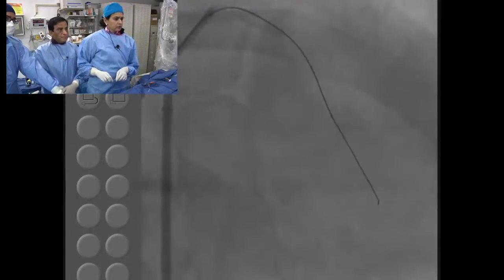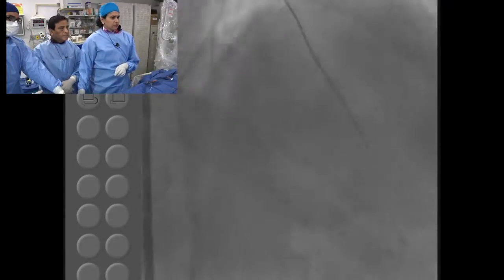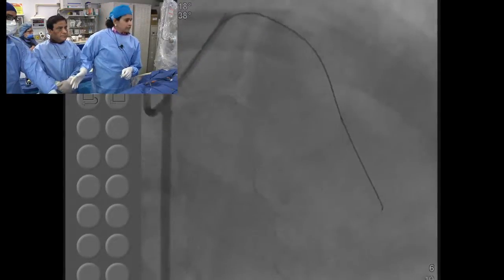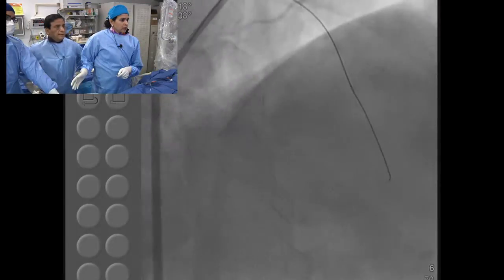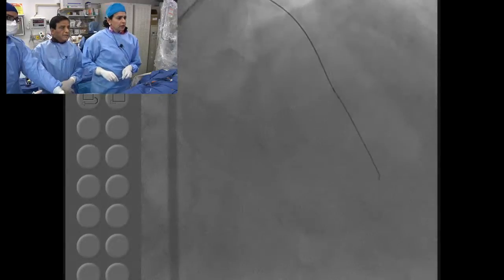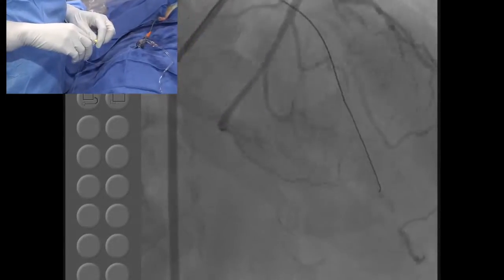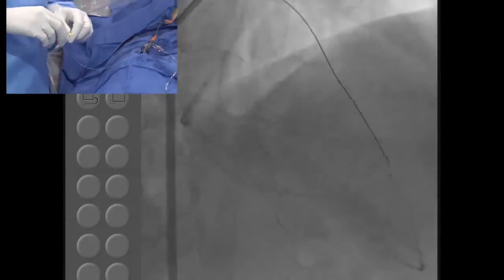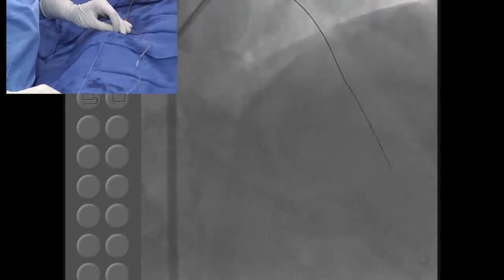Anu, beautiful job with the wire in the meantime. I think you appear to be on the right track. I want you to describe the motion which you have been doing, would you call it drilling? Yeah. We have to inject. I think it may be parallel versus subintimal. Yeah, let's take a picture. It's subintimal. It is subintimal, okay. You need to pull back a little more. You want to get a Zions, the Confianza Pro?